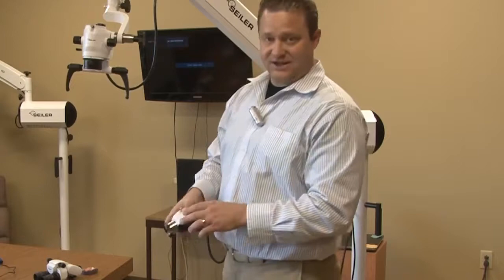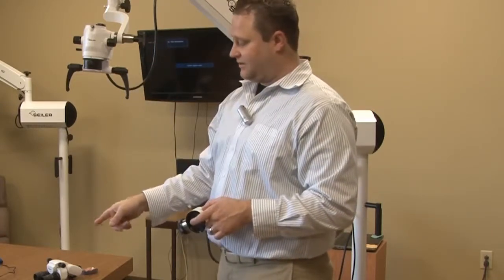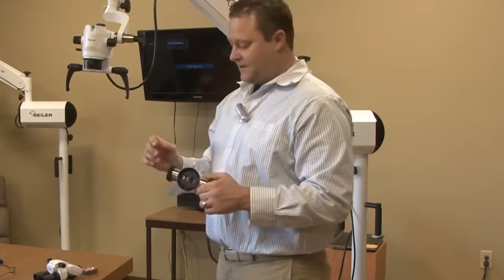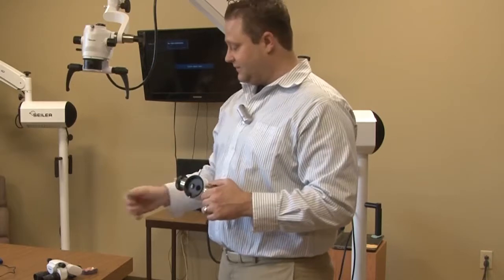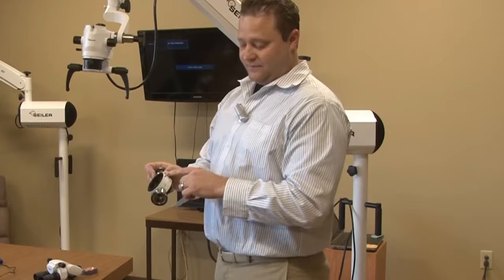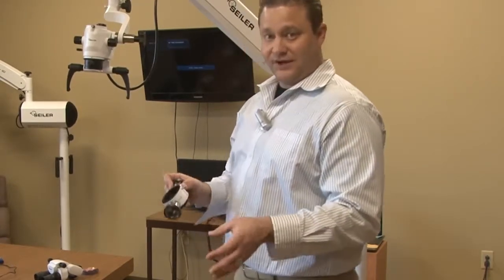Now, with today's cameras, they're so good that they have individual iris diaphragms that can basically block out the light of each one. So honestly, you can put the CCD HD video camera on either side — 50-50 or 80-20 — depending on if you're right eye or left eye dominant.